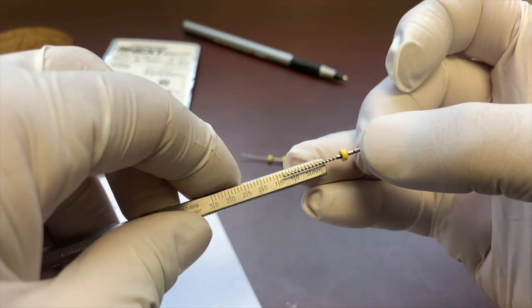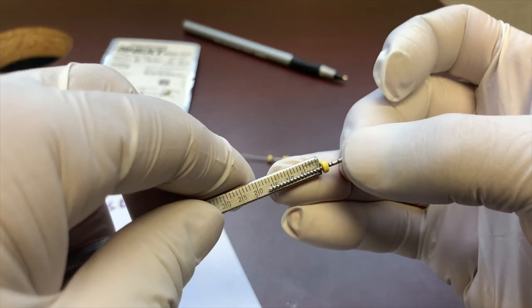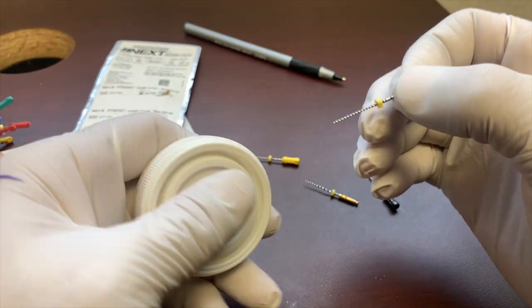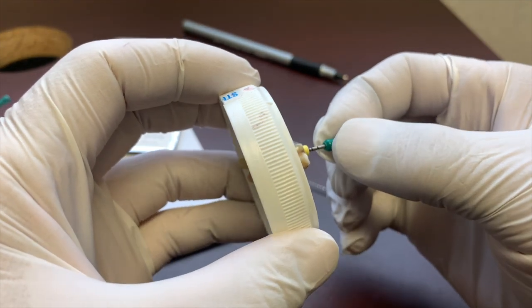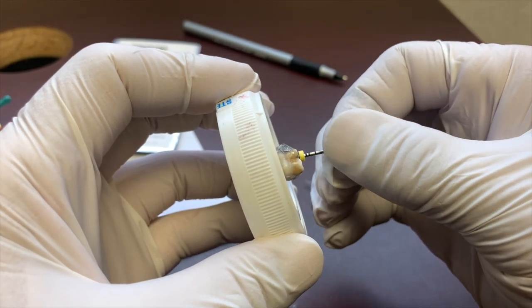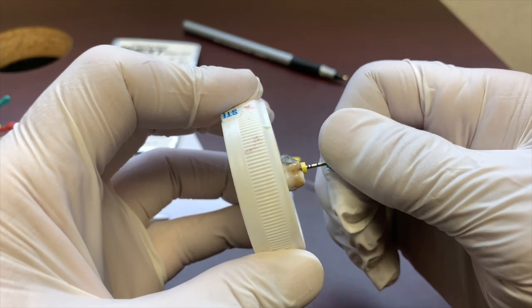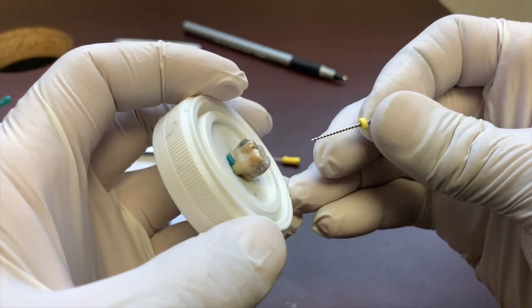I'm doing that with one red bar minus 17, subtracting, about there. You can see this is pretty stiff, so you gotta be careful in doing these types of cases. What we're gonna do is our balanced force technique. So it's gonna be a quarter turn in, and then apical pressure and down. These larger files, you typically don't hear much. So I'm doing my apical preparation right now. I'll do 3 cycles, and then let's take a look.